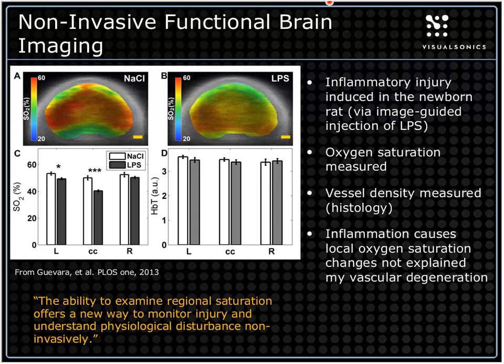I just wanted to include a quote from the actual paper. They say, "The ability to examine regional saturation offers a new way to monitor injury and understand physiological disturbance non-invasively." And this kind of sums up what we have to offer as far as ultrasound and photoacoustics for brain imaging.